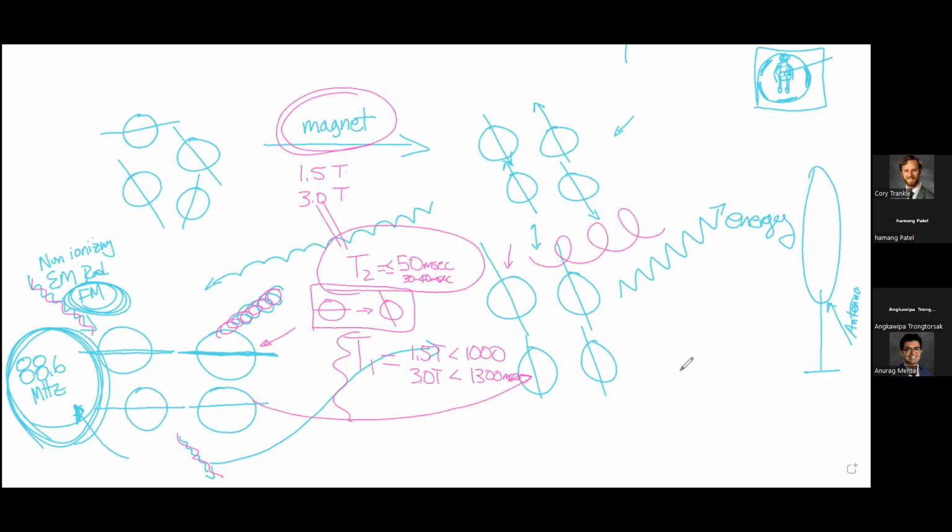in these terms. You have protons that are spinning outside the magnet, top left, in a random fashion, all right? Then we go inside the magnet and we force all those protons to align their spins. Then, coming down here, we pass through a non-ionizing FM radio wave.